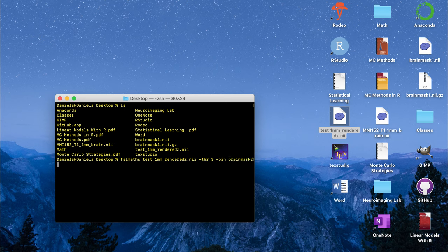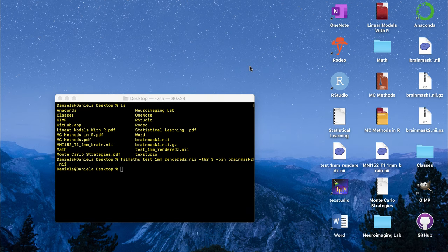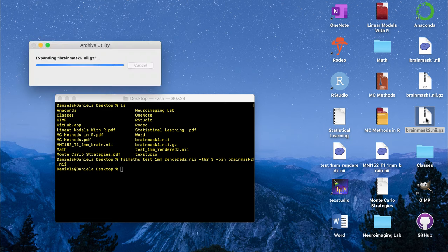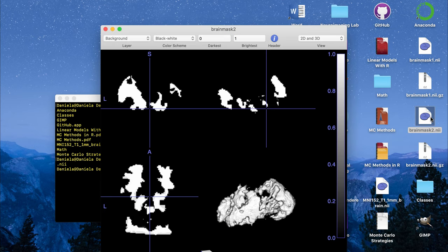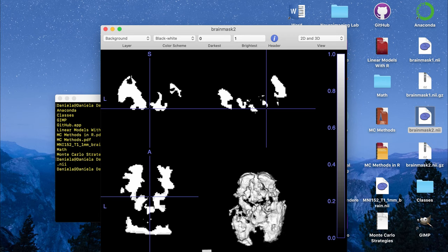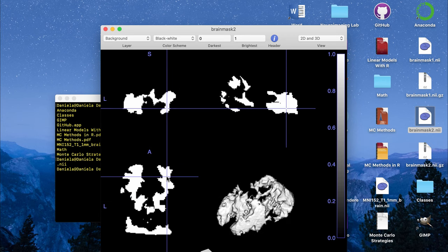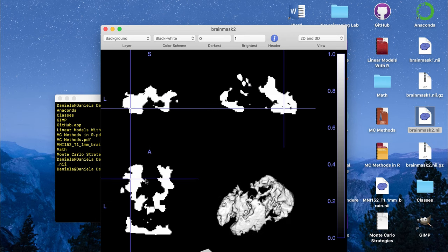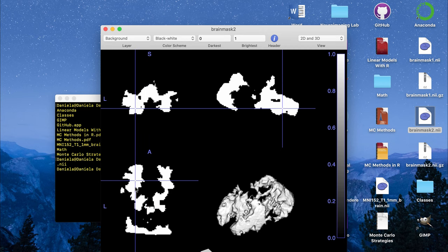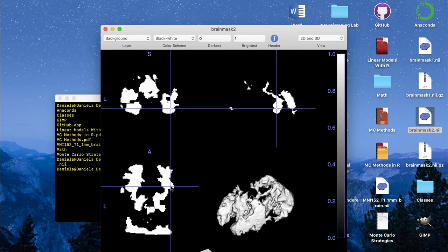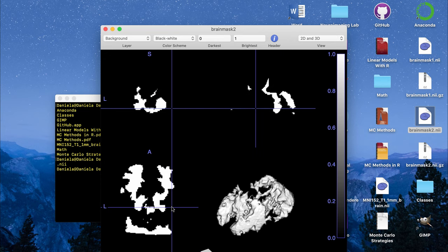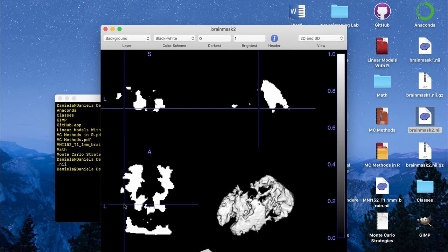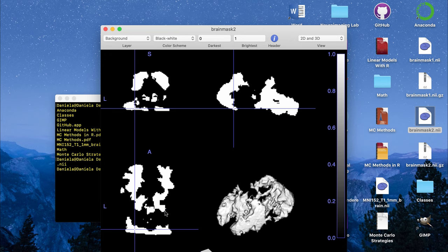I'm going to call it brain_mask2.nii. I'm going to click enter and then again that will take a minute to run and it creates the brain_mask2 file that's compressed. Then when I open that brain mask file we see that it has created a binary nifty file again where values are either 0 or 1. The region of interest was just the activated areas and those all get a value of 1. Any area of the brain that was outside of that activated region gets a 0.